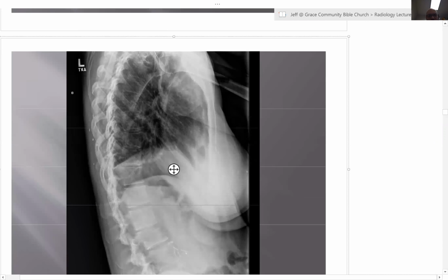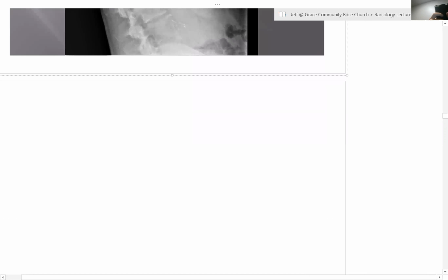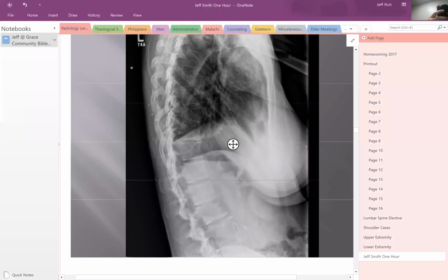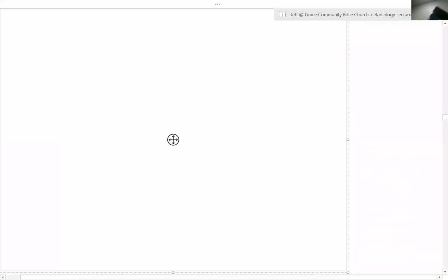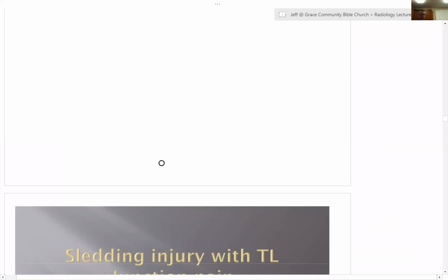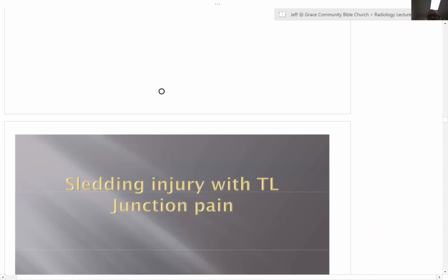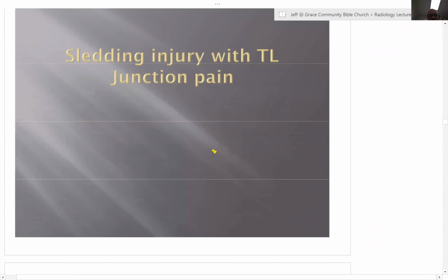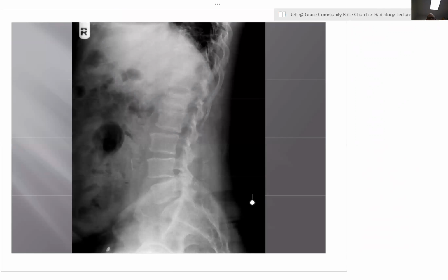All right, sledding injury, maybe next case. Okay. All right, well, let's see, guys. Can you just keep it minimized like you had it before? There. Yeah, I'm hoping that we got it going here, but we're getting close to closing, but this is definitely not what we want here. There we go. Okay, take a look at this while it's up.